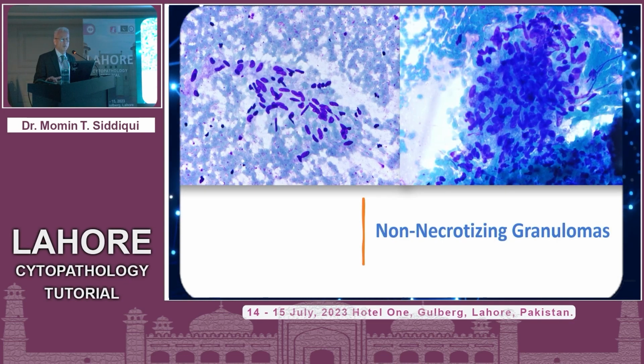Non-necrotizing granulomas, again, this is obviously an easy call. If there is a concern for tuberculosis on necrotizing granulomas, further workup can be done, but categorization is negative. I mean, these are just considerations for discussion.